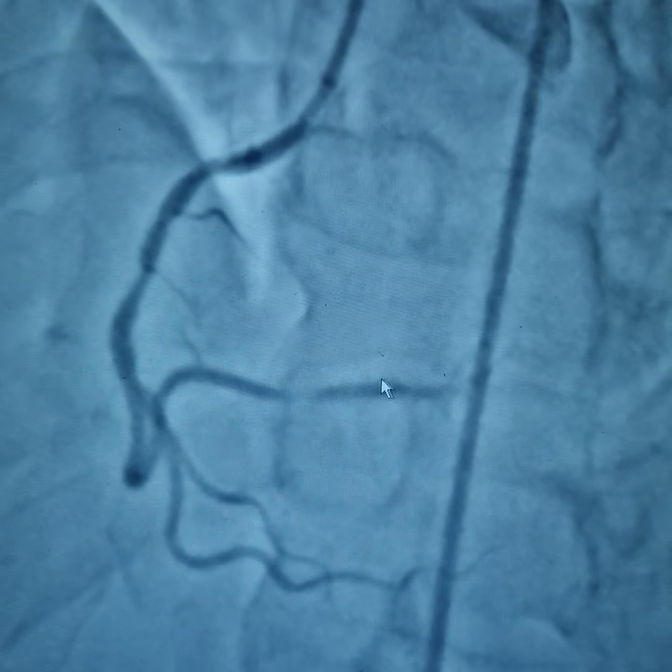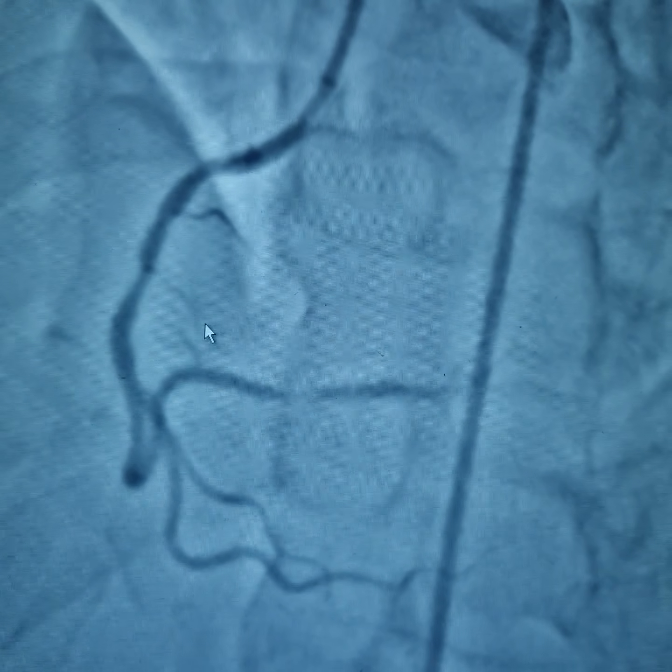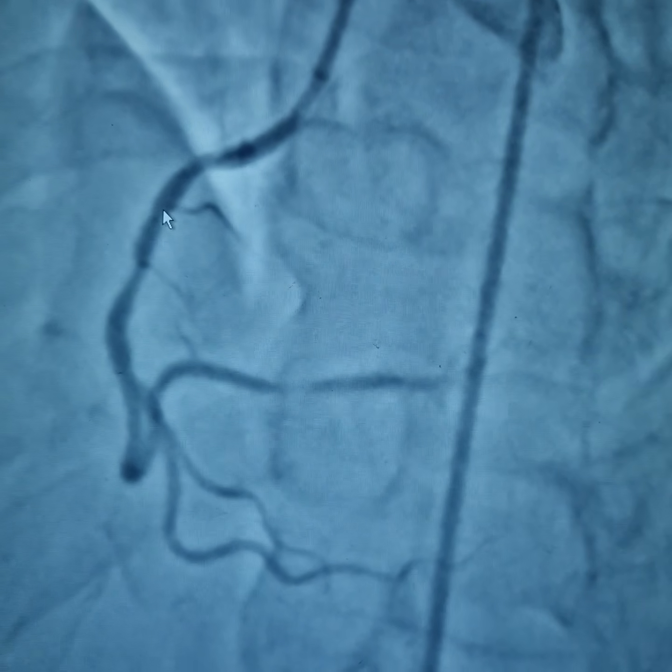that it's a tight lesion right here. It's a 90% stenosis. This is about 80%, and so we're going to take the patient for angioplasty and stenting.